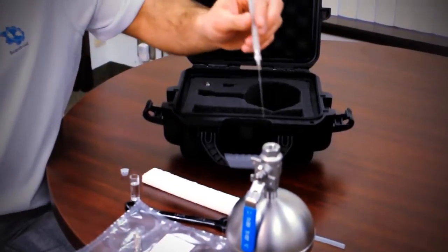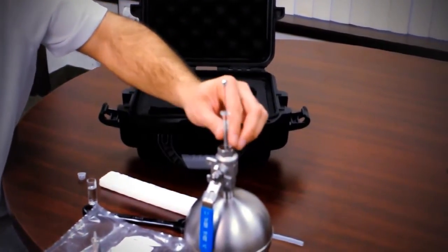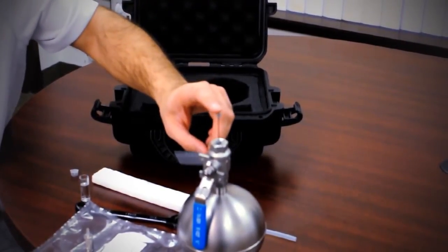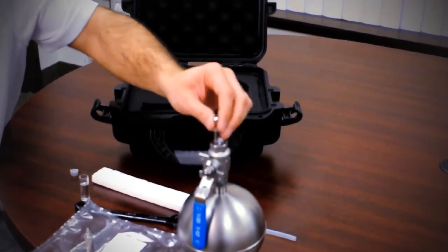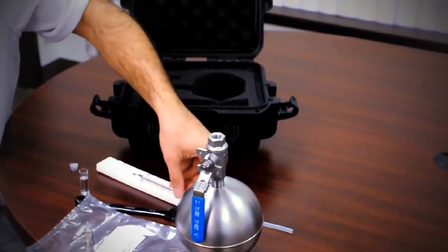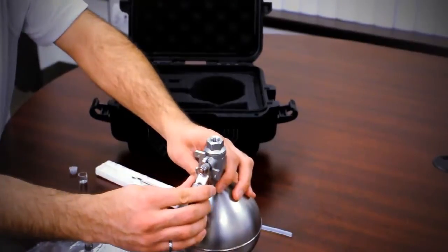We then insert the syringe all the way into the canister, empty out the syringe, shake it to make sure everything gets into the canister, and close the valve.